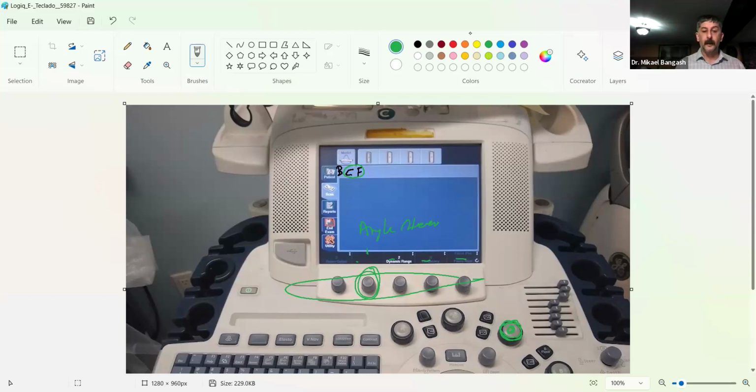Now, when I say angle steer, it really doesn't matter. You can turn it clockwise and just keep on clicking. What you will see is that with each click, your box may go from this to, let's say, this. And from this, the next click will be like this.